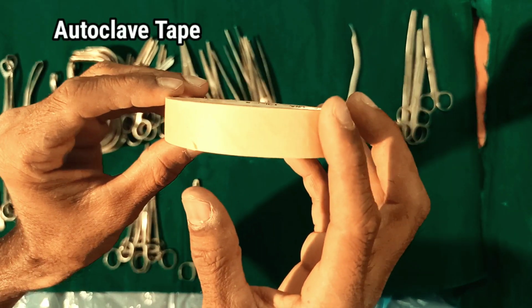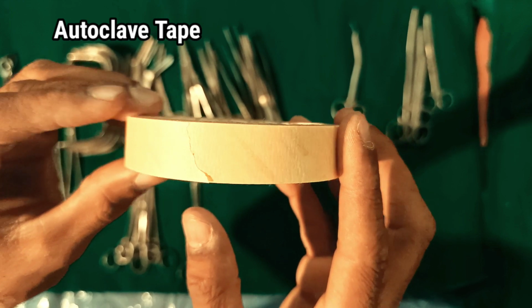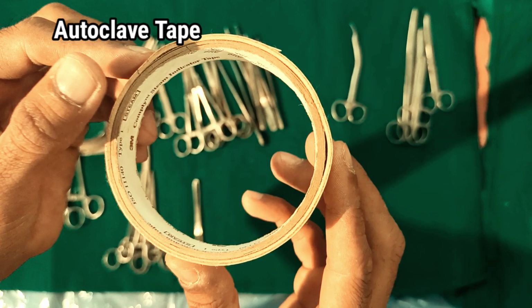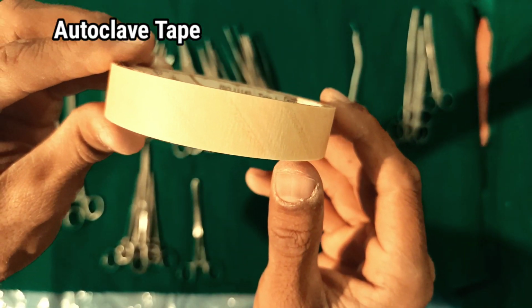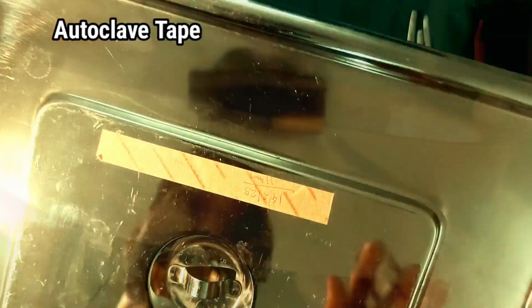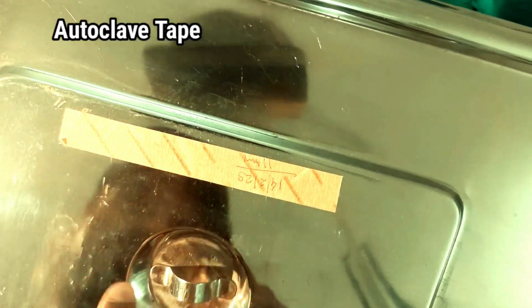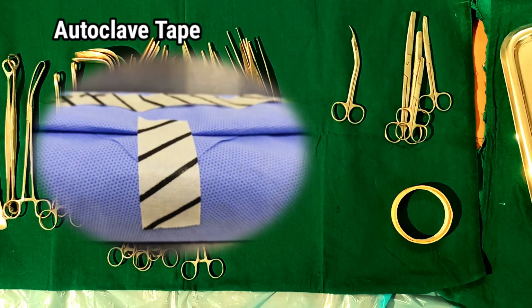Autoclave tape. Autoclave tape is an adhesive tape used in autoclaving to indicate whether a specific temperature has been reached. Autoclave tape works by changing color after exposure to temperatures commonly used in sterilization procedures, typically 120 to 121 centigrade in a steam autoclave. Small strips of the tape are applied to the items before they are placed into the autoclave.